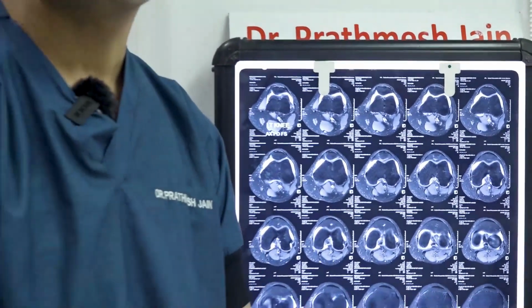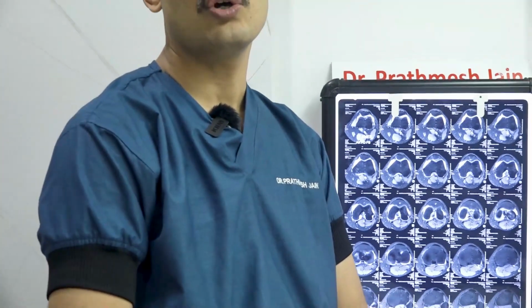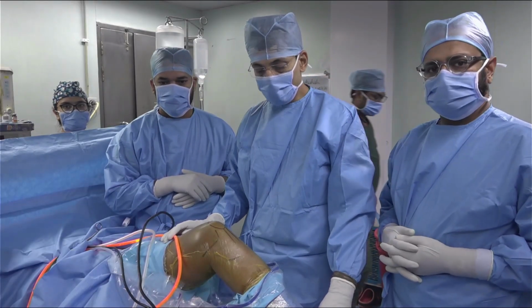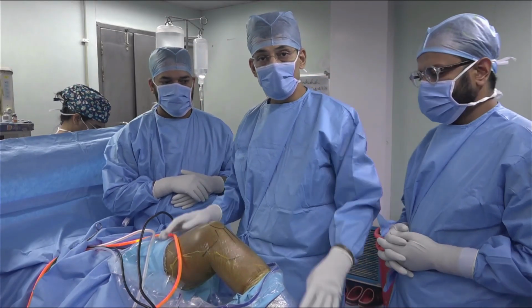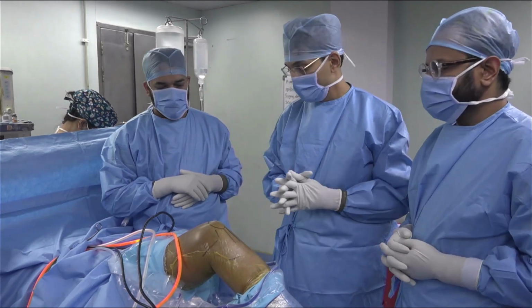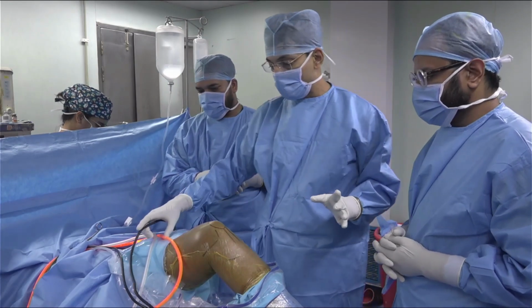So let's start with the live surgery, and I'll be focusing on the technical pearls during the live surgery. Thank you. So good morning everybody. We are starting the live surgery. Before starting, I would just demonstrate the position and the portals. This is our routine setup that we do.